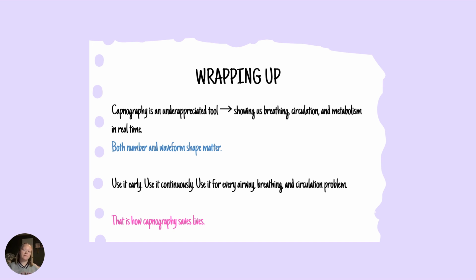Capnography, my thing to say about it is use it early, use it continuously, and use it for more than just intubation. Use it for all airway, breathing, circulation problems that you might have. It can tell you so much more at the root. So this is how capnography saves lives.